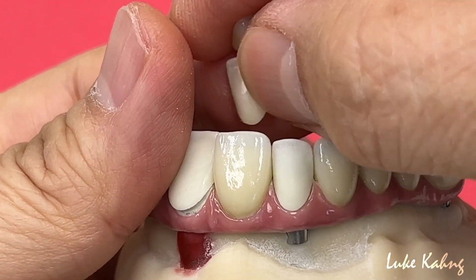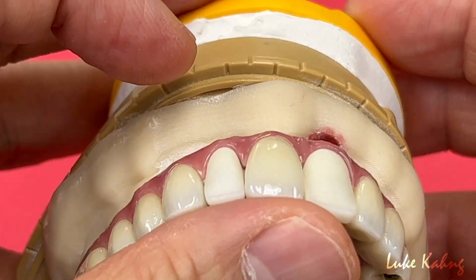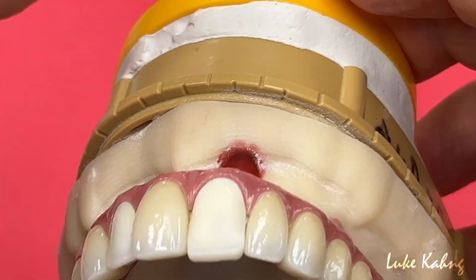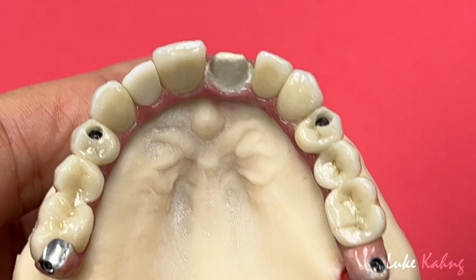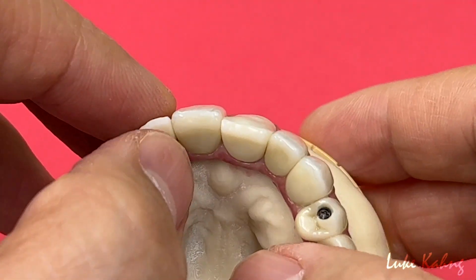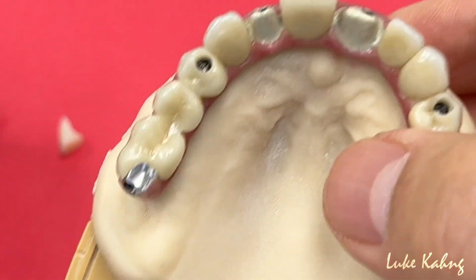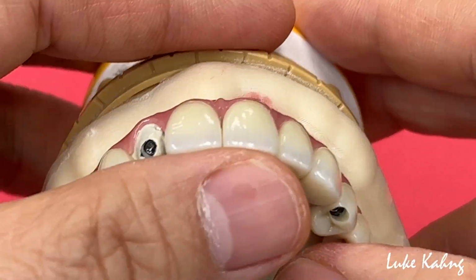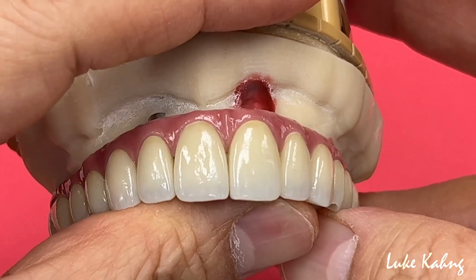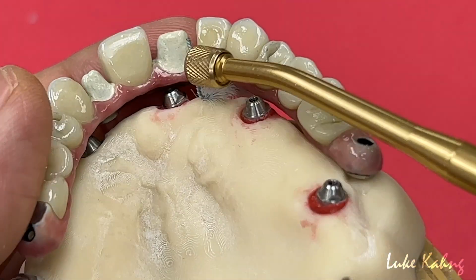Here's another tip regarding the facial hole. That much room. The problem is seeing the color through from inside, which will cause an issue in the future, the value. We tried a second time, here a little bit thicker than the other one, and it still has just a little tiny bit of gray. So that's why we made this thicker. See here, same thing. We maybe put in the value, so that we don't have any problem, even though the doctor is using whatever shade they have. Now this is the main cleansability, so we can solve all this issue.